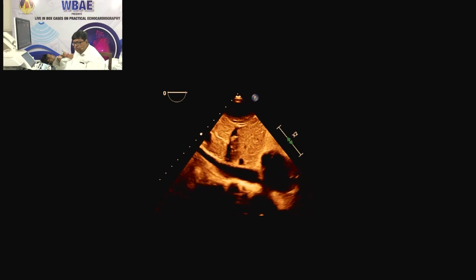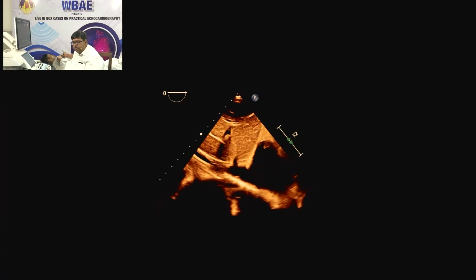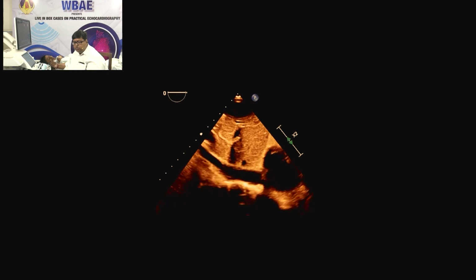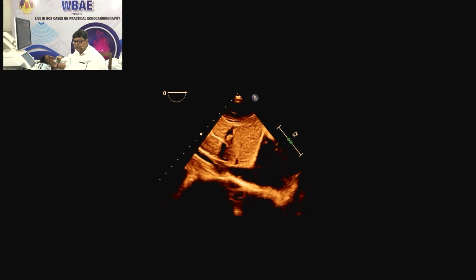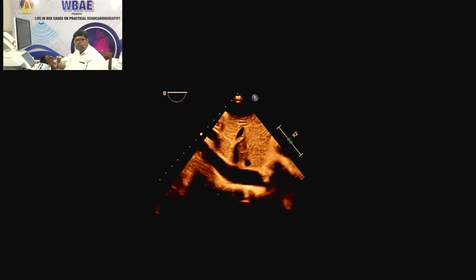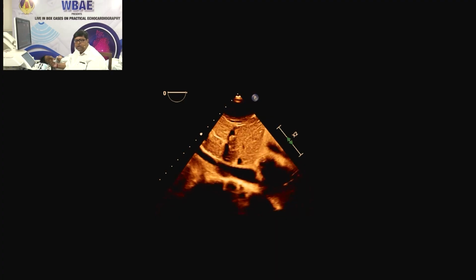Now, the point to note is why this mitral regurgitation is occurring in this case. In fact, this is occurring because the masses are coming in the line of coaptation of the valve leaflets, and there are two mechanisms actually of mitral regurgitation in this setting of infective endocarditis of mitral valve, and that is either leaflet perforation or coaptation failure of the leaflets, and these usually occur when the vegetations are attached near the middle of the leaflet or towards the apical part of the leaflet.